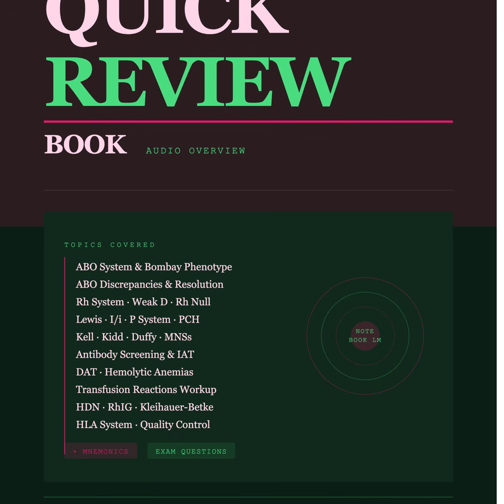Right. AHG is an engineered animal antibody, usually from a rabbit, that is specifically designed to hunt down and bind to human IgG molecules. The entire goal of the test is for the AHG to drop into the tube, find the human IgG antibodies that are attached to the red cells, grab onto them, and link the red cells together into a visible clump. But what if you didn't wash well? What if there are still thousands of unbound human IgG antibodies just floating freely in the saline liquid?